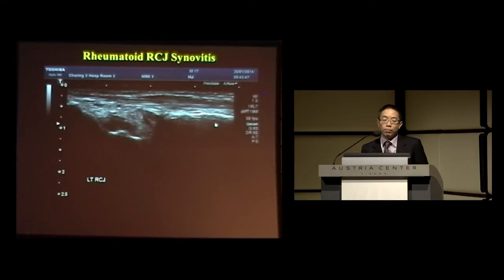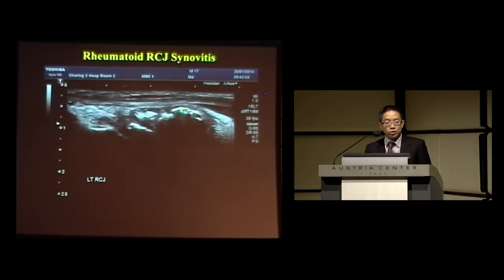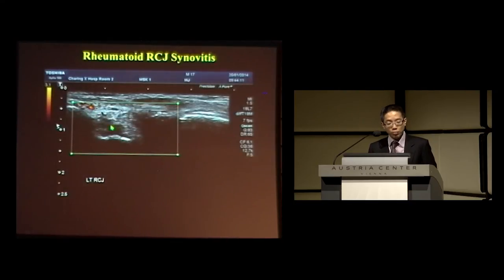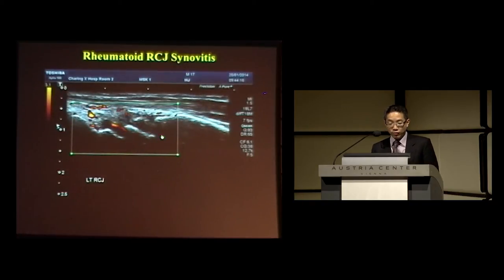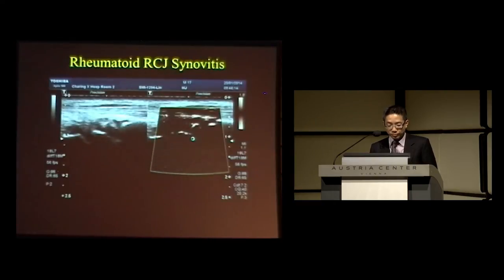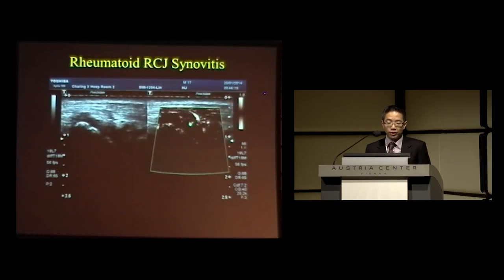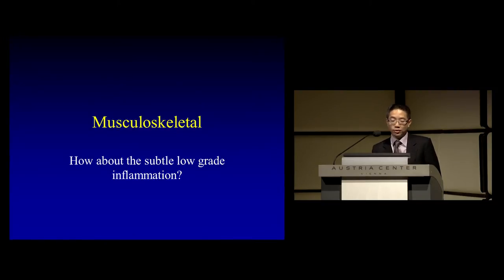Here's another example of a patient with rheumatoid arthritis, and this is the extensor surface, the extensor tendon. On the B mode image, you can already see that there is irregularity of the distal radius and some synovial hypertrophy. And is this active? Well, when you turn on power Doppler, you do get an appreciation that there are some vessels flowing into this inflamed area. But this becomes much more apparent when you turn on SMI. You can actually see a vessel diving in and this branching network pattern, which you appreciate much better with SMI.